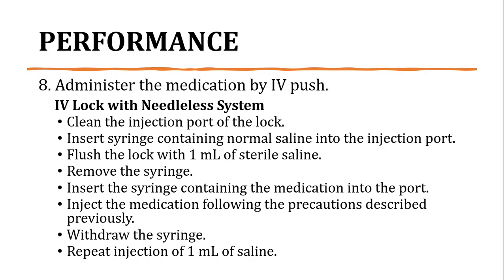The next variation of IV push, administration of the medication by IV push, is through IV lock with needleless system. Sa system na po na ito is no need for the needle because directly yung syringe is ina-attach na agad sa IV lock. First one is to clean the injection port of the lock to maintain the sterility of the procedure and prevent the introduction of microorganisms to the vascular system of the client.